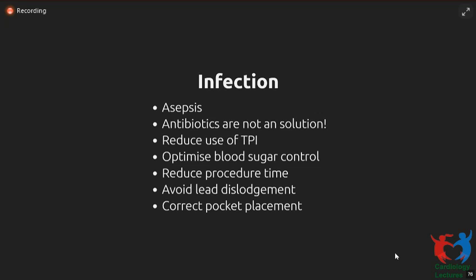Most patients do not require a temporary, and just keep it in mind that putting in a temporary increases the risk of DVT, adds a small risk of perforation, and adds to your risk of infection. So unless you have benefits which clearly outweigh all these risks, try to avoid using a temporary.